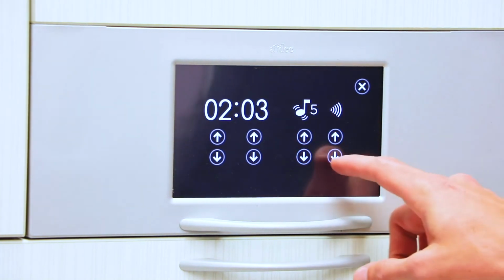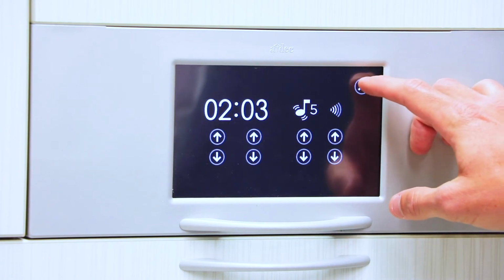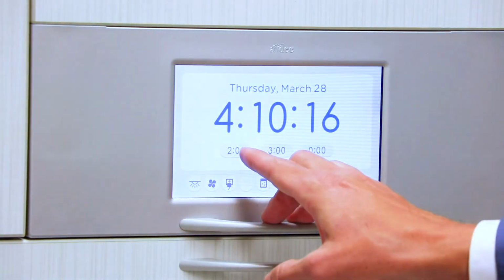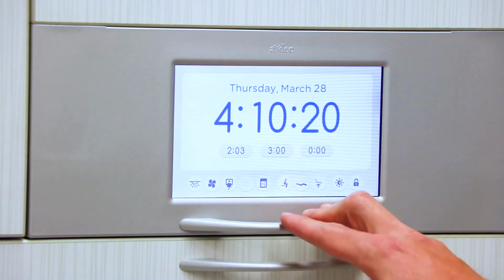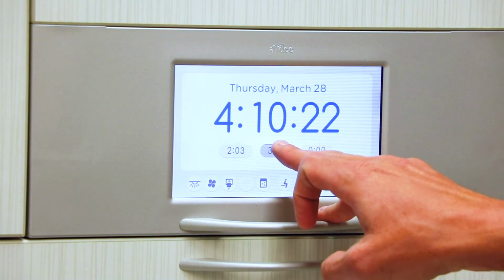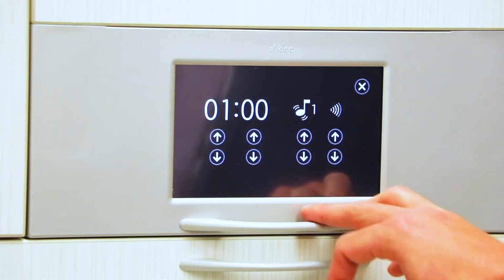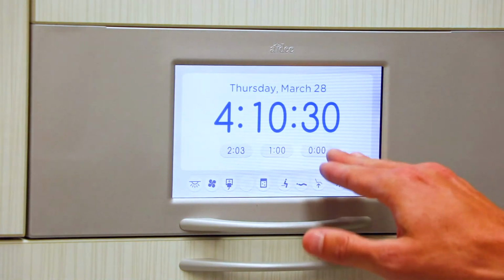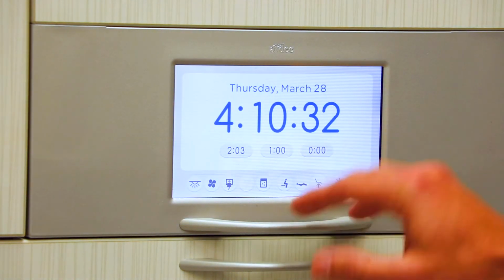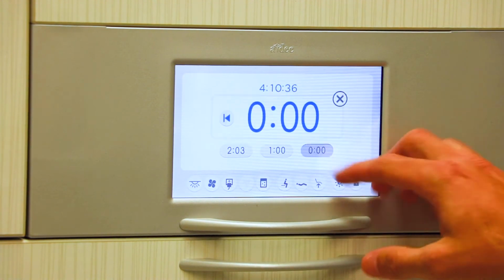And you can increase or decrease the volume based on what you would like that volume to be. So now that timer I just changed from 6 seconds to 2 minutes and 3 seconds. The one next to it we could also change if we wanted it to be a minute. We can make that drop down to a minute. We can change that chime. Once again, that's going to be set for that one. The last stopwatch, if you will, defaults to 0 as far as the time is concerned. And that will actually count up.